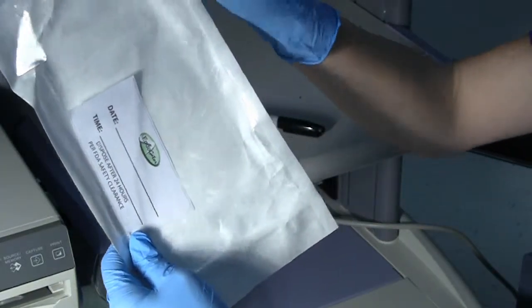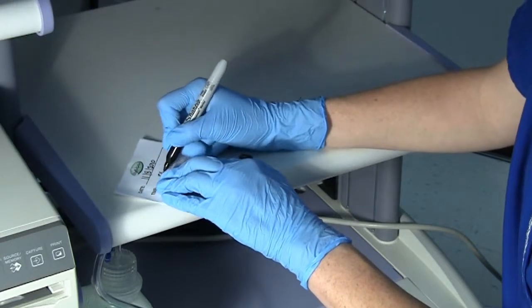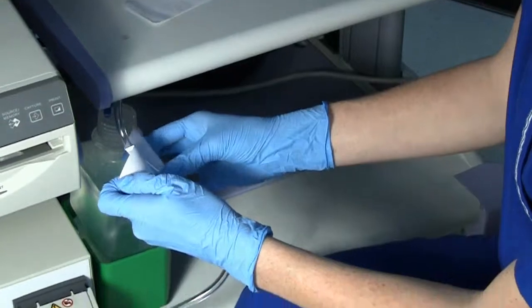Each endogator comes with a date and time sticker in each package. Take the sticker out and fill in the appropriate time and date. Then place the sticker around the endogator tubing.